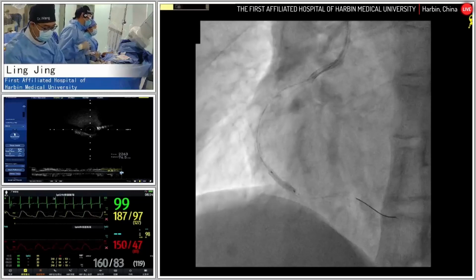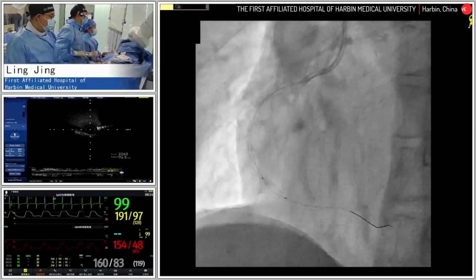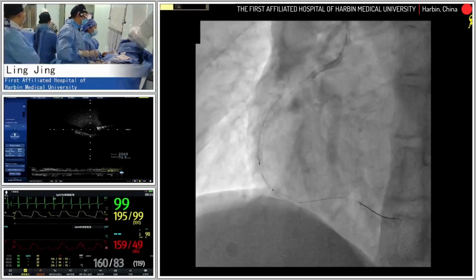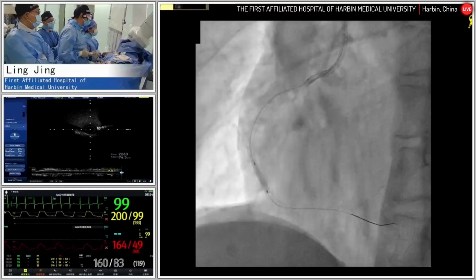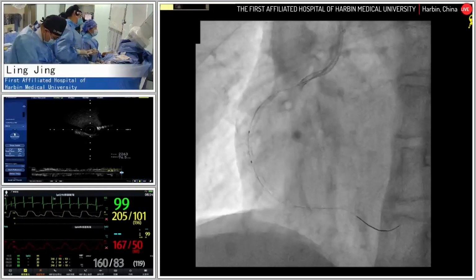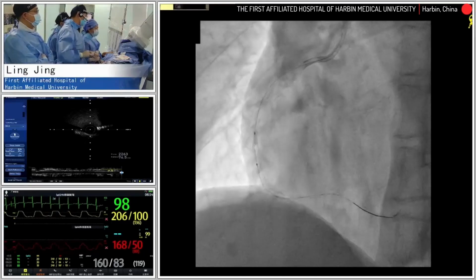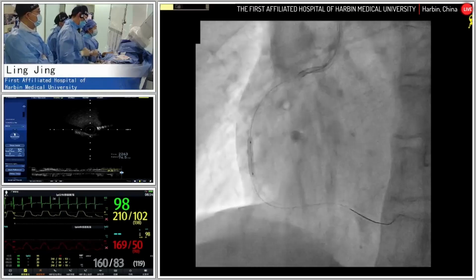14, 16, 15. Okay, done. 16, 18, 18. 16, maybe 20. 18, 20. 20. Okay, done.